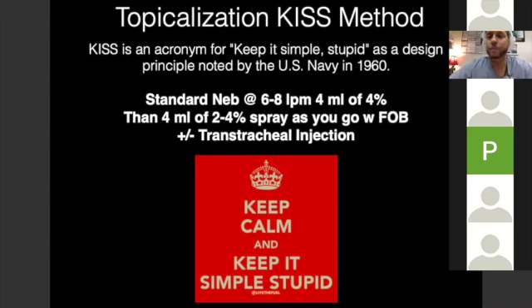First, you have them inhale deeply, right? So they inhale deeply, then you spray, and then they'll cough it up because you want to bring the local up to the cords, up to the mouth, the higher end of the trachea. If they exhale and you spray, they're going to breathe the local down here. That might be good for bronchoscopy, like a pulmonologist would want to do, but we want up here. So we want to have them inhale, then spray, and then they'll cough it up.